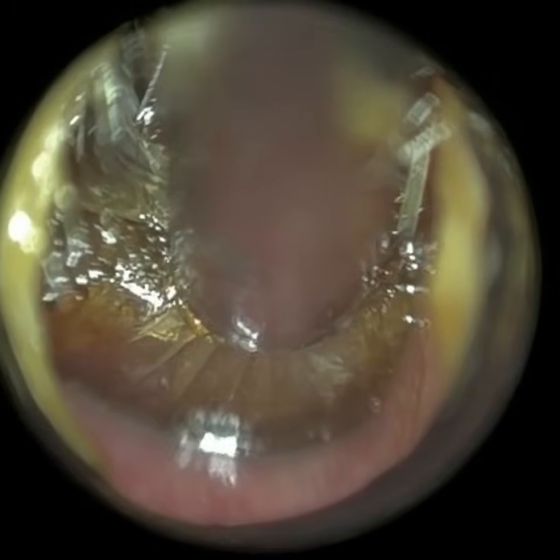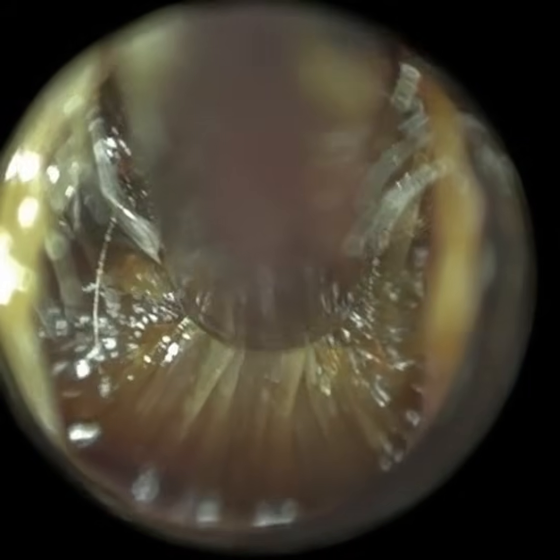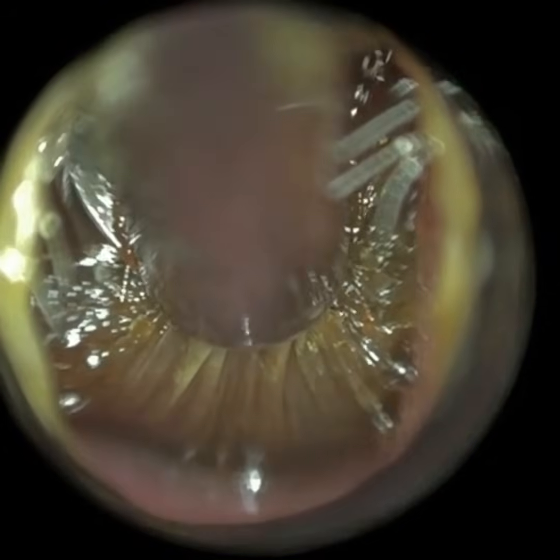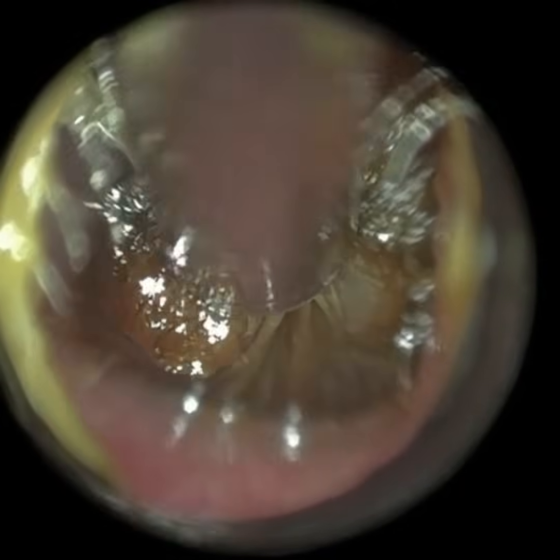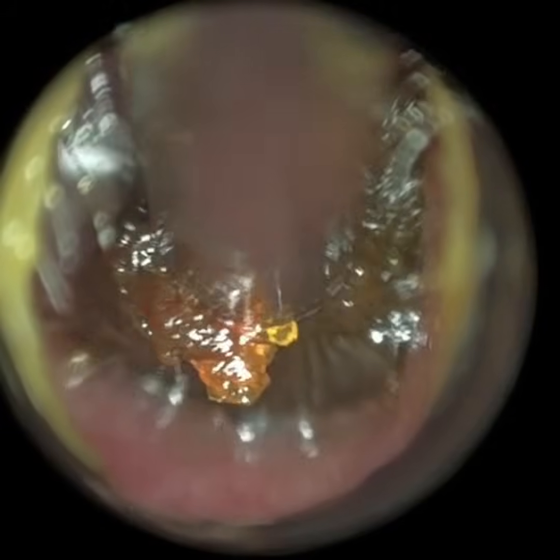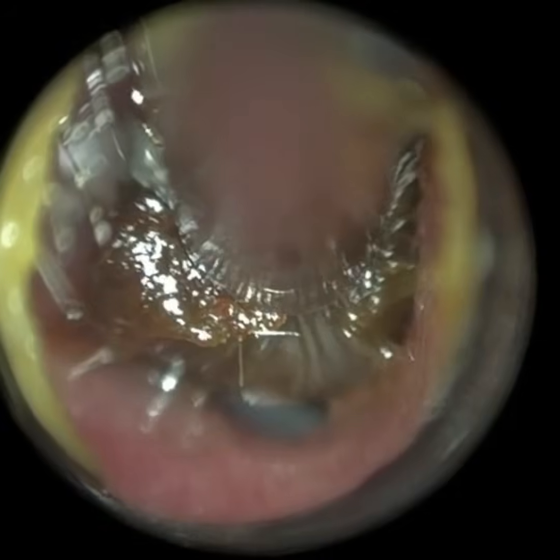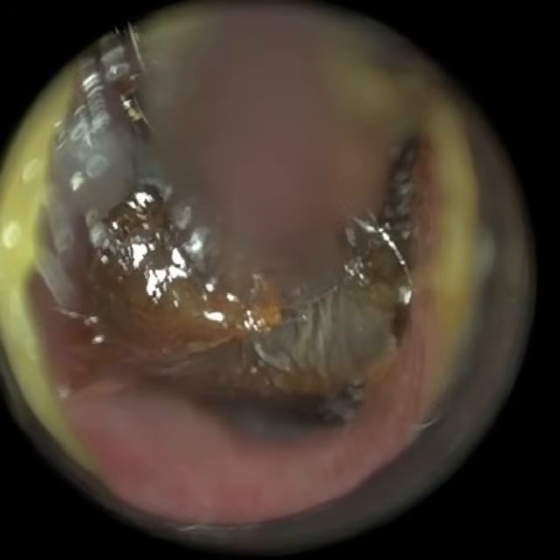So this patient does use olive oil drops on a regular basis, and they do so because it helps when they use it temporarily, but then it comes to the point where the drops are no longer useful. Today was okay, but sometimes the patient can overuse the drops, and then it's very difficult to remove the wax out of the anterior recess. So ideally you want the wax to be a bit firmer. This is just about okay. I have put some fresh oil in there to coagulate and bind it. So you can see some of the eardrum appearing at 6 o'clock. And when it's firmer, you can take it out in one nice plug, and we managed to do that.